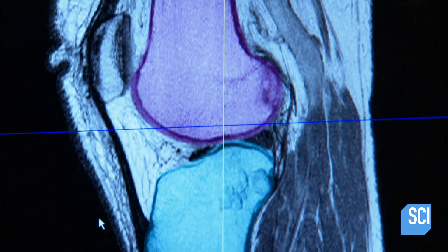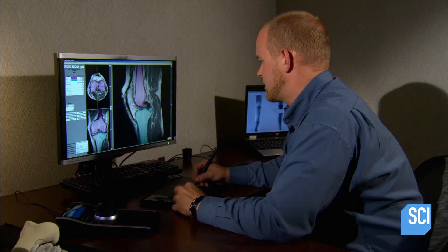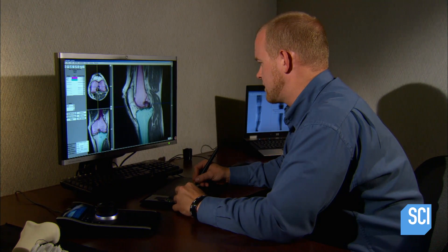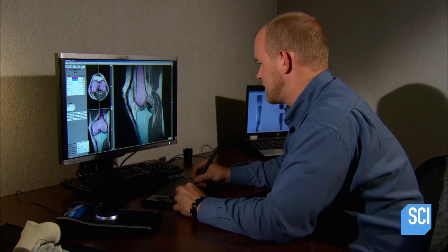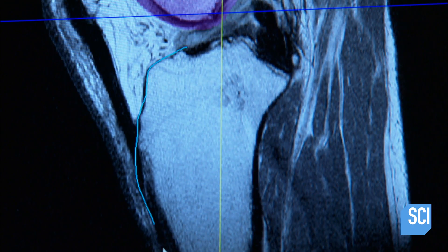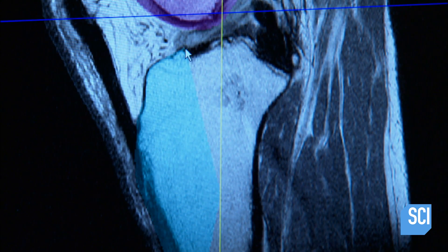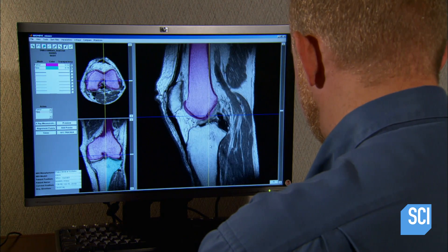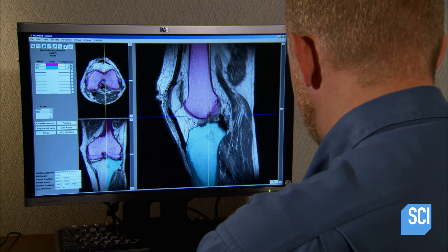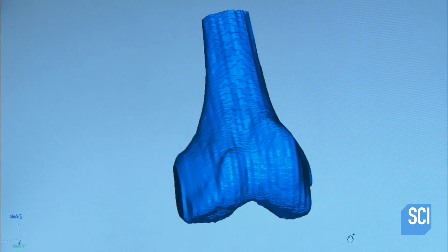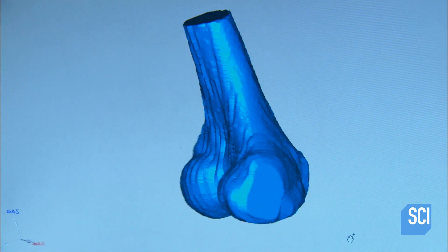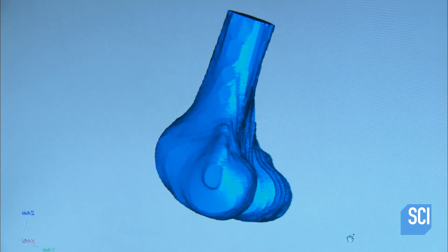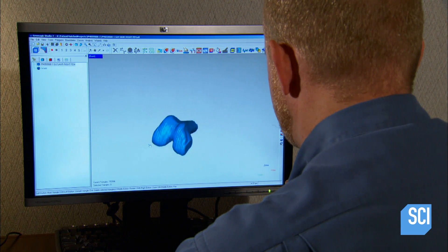The surgeon no longer has to visually calculate the bone cuts on the spot in the operating room, which takes more time and is more invasive. An engineer uses the MRI scan to create 3D models of the patient's femur and tibia. The patient's cartilage has worn out in between these bones, causing painful rubbing that erodes the bone surface. The implant effectively replaces the damaged bone and cartilage.